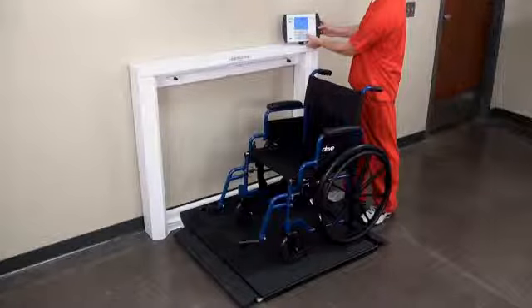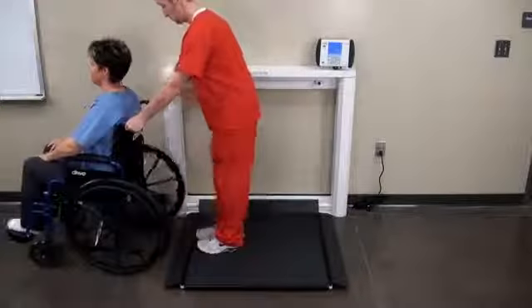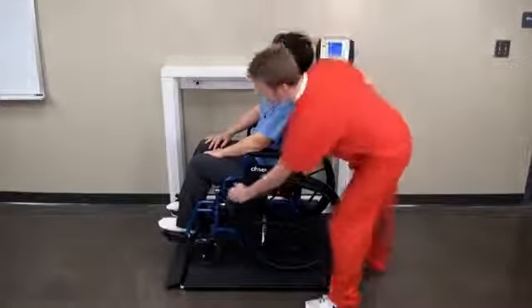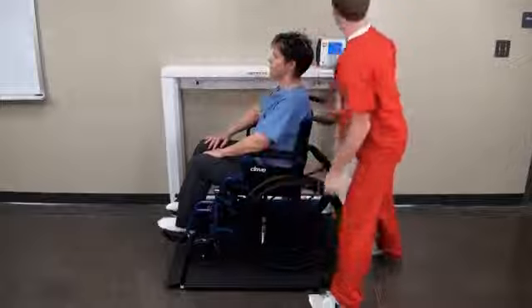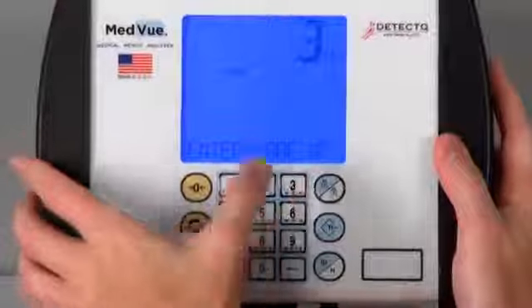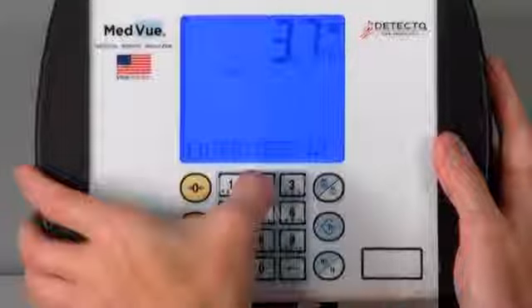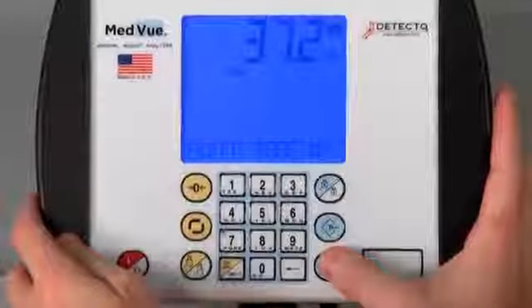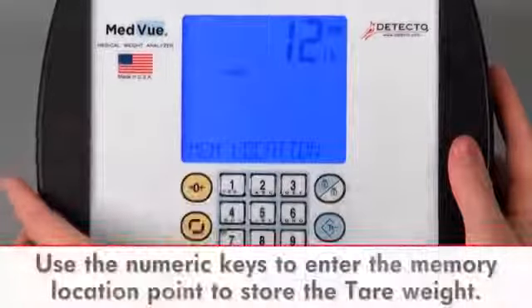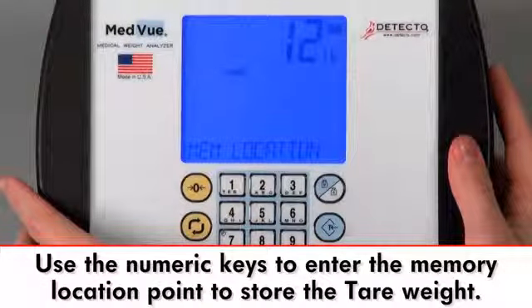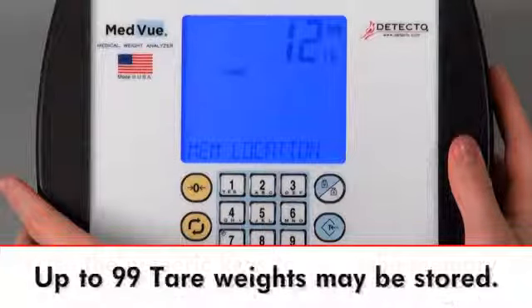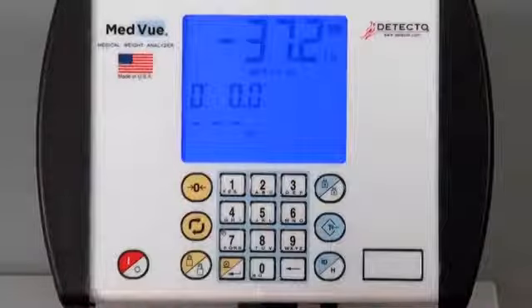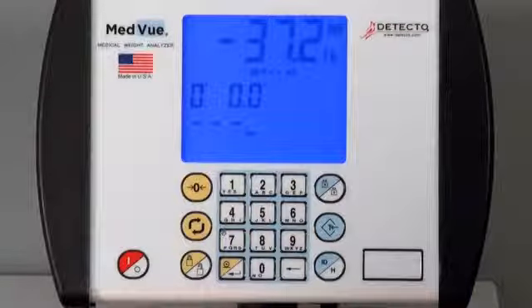Tare weights can also be stored and later recalled. This allows you to enter the weights of several different wheelchairs into your scale's memory and recall them later when using those wheelchairs to weigh patients. After entering or measuring the tare weight of an object, instead of pressing the Enter key, simply press the ID Height key. The display will then change to ID. Use the numeric keys to enter the memory location where you would like to store the tare weight. Up to 99 tare weights may be stored. Press the Enter key after assigning the ID and then weigh the patient as required.